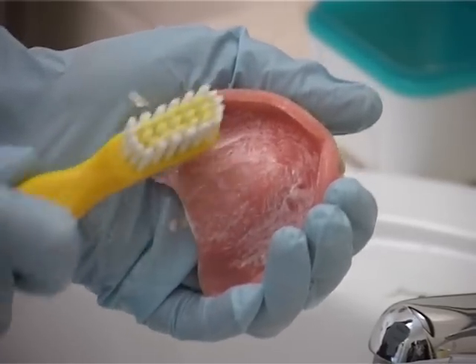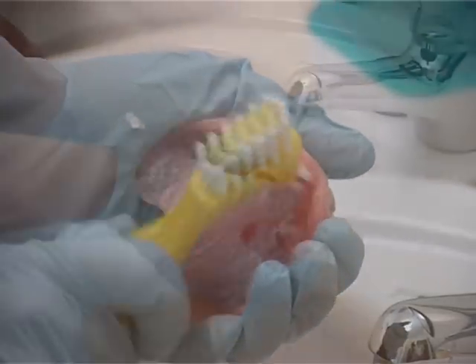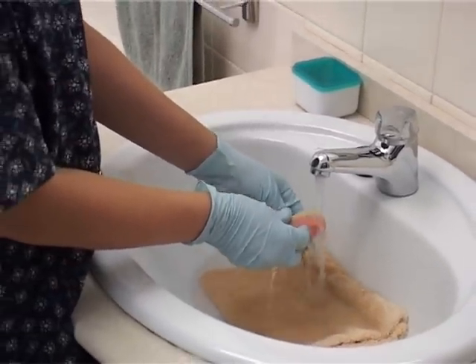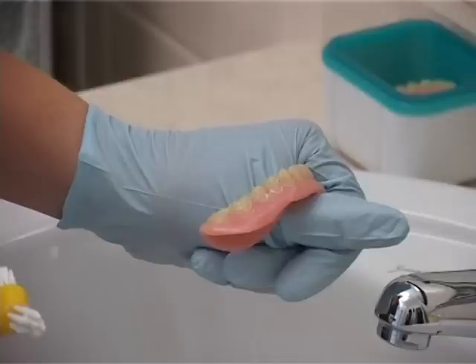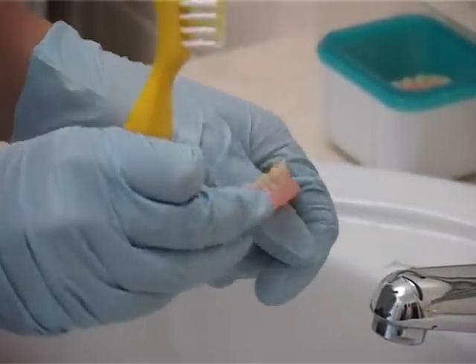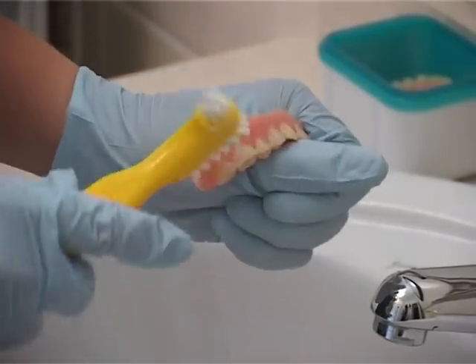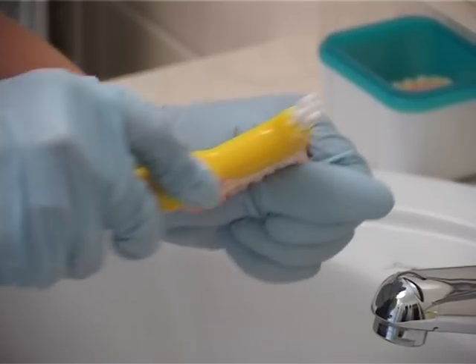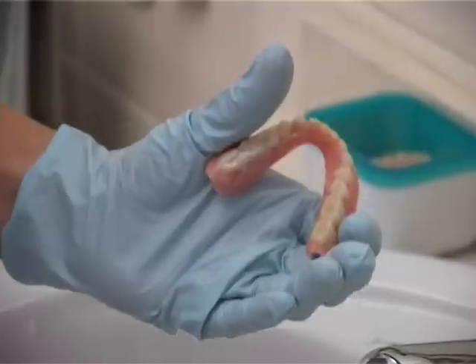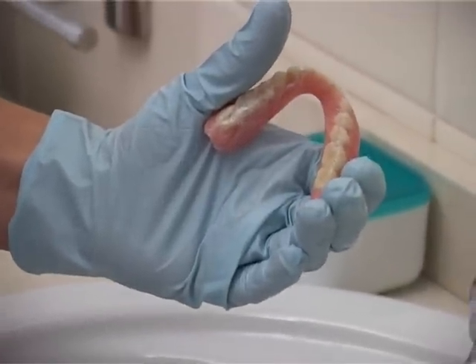Never use denture paste for natural teeth as it doesn't have any fluoride in it. Hold the lower denture in the palm of your hand to clean one side and then the other side. Never hold it in a way that can cause the denture to snap in half.